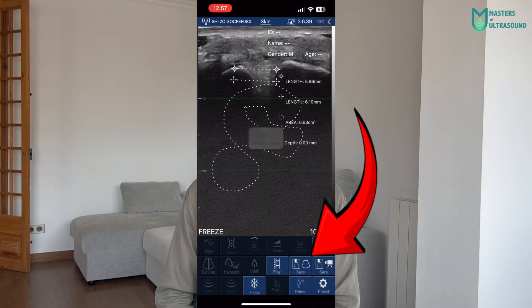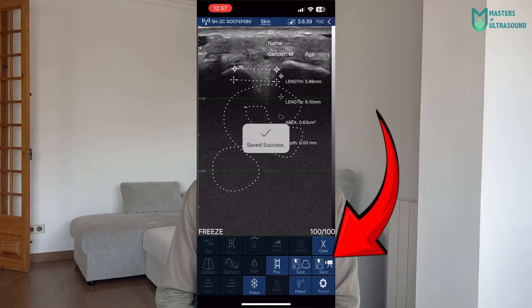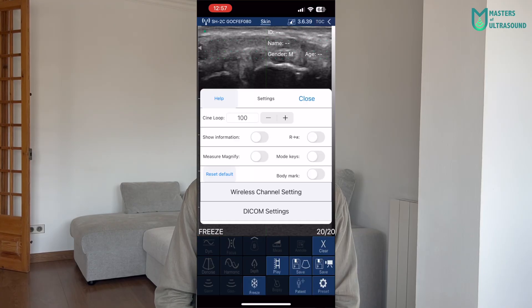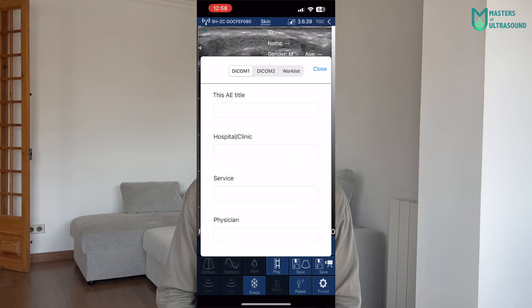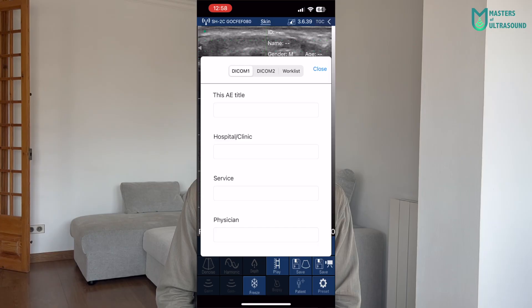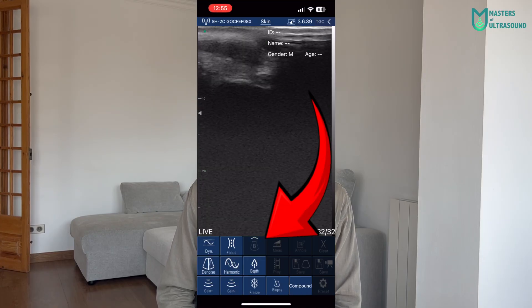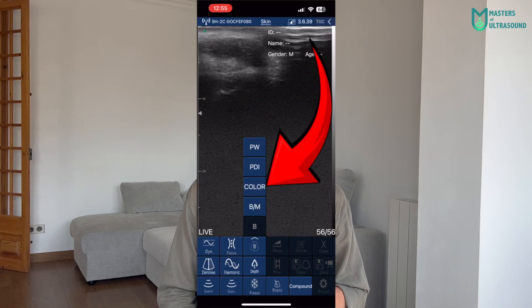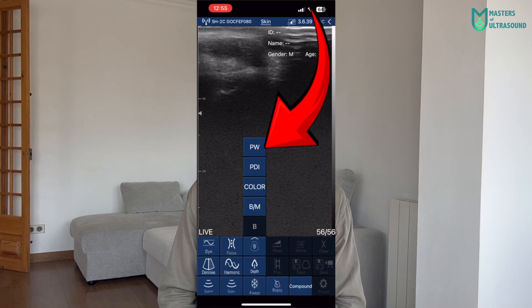The app lets you save anonymized images and video clips in JPG, PNG, MP4, and DICOM formats directly to the iPhone, making it easy to share with other people without the need for a subscription, cloud, or special app. It comes with the following imaging modes at no extra expense: B mode, M mode, Color Doppler, Power Doppler, and Pulsed Wave Doppler.